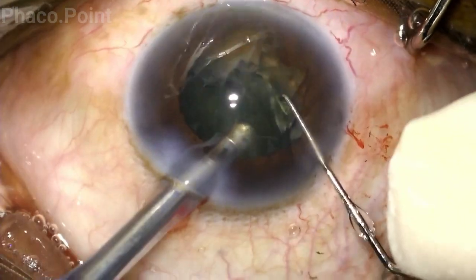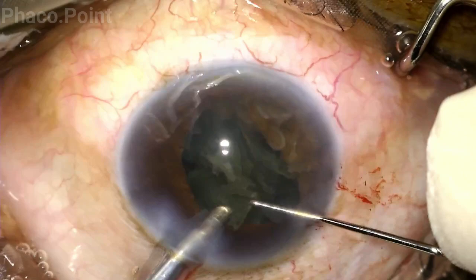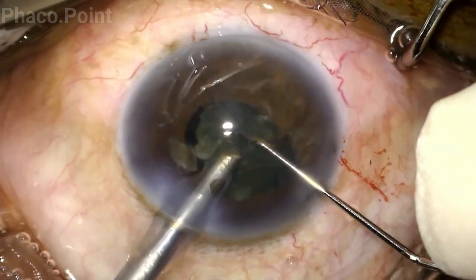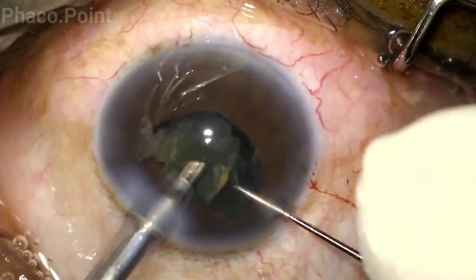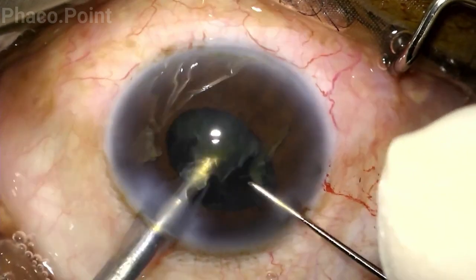While working proximally, you must ensure that the irrigation ports do not accidentally get trapped within the main incision, because that could result in a problematic surge. Finally, if the pupil does seem to be getting smaller, one could inject a dispersive viscoelastic to achieve viscomydriasis intraoperatively at any step.